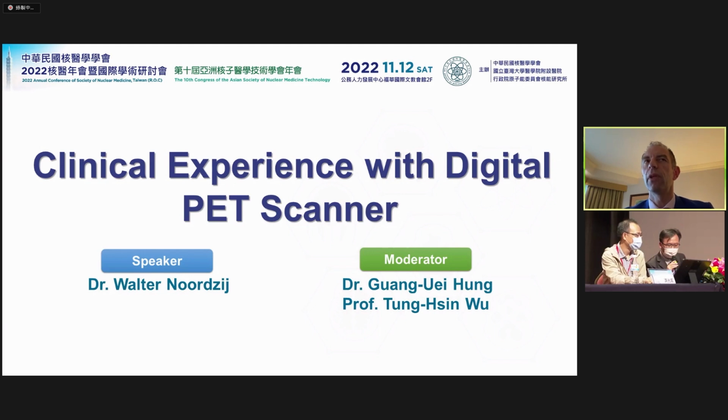If I understand correctly, your question is whether you can change the time of flight? Actually, I'm not aware of the option of changing the time of flight from 500 to just 200 picoseconds. In my experience, we perform our acquisitions with the time of flight option always on. So we never perform acquisitions without time of flight. I guess that our clinical physicists do not support switching off the time of flight option or altering it.